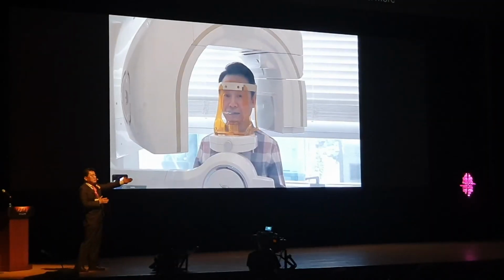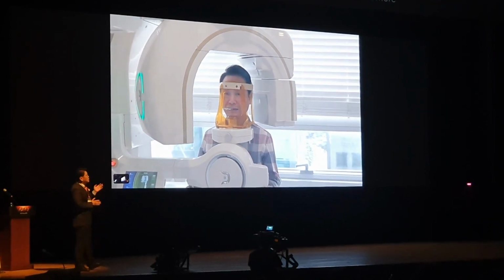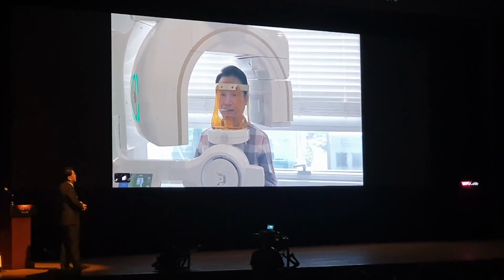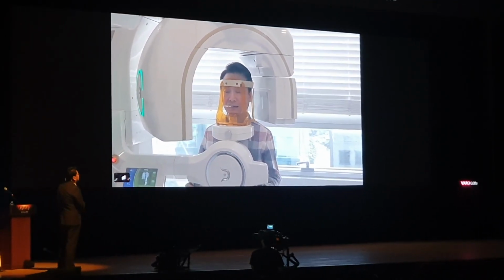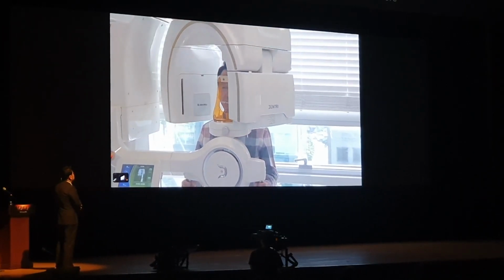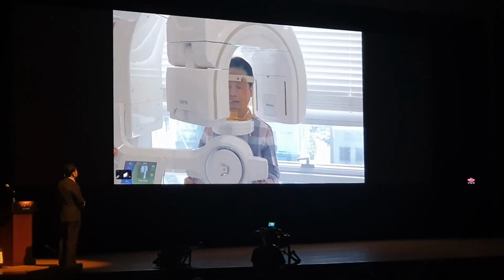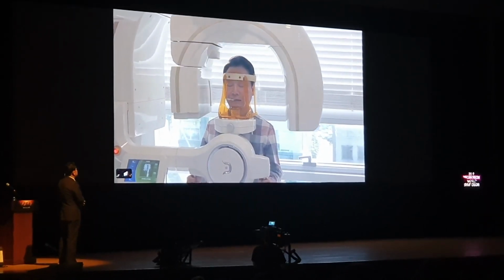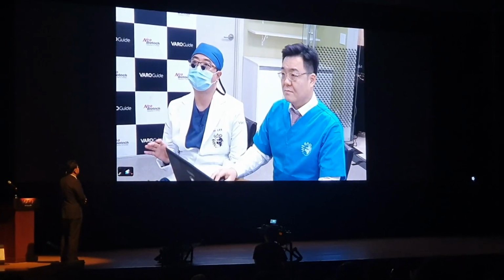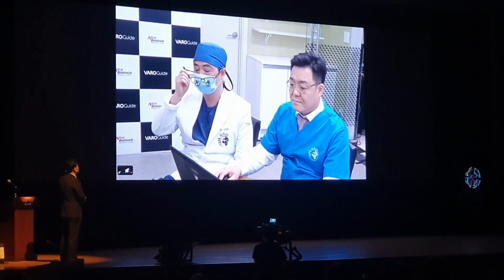So everyone on the left of the stage, the timer is displayed to count every second. You can check the screen to see the total surgery time up to this point. Yes, CT scanning started just now. Once the scanning is complete, the next step will be moving the CT data to the software and starting planning. After planning, it'll go through the milling process.